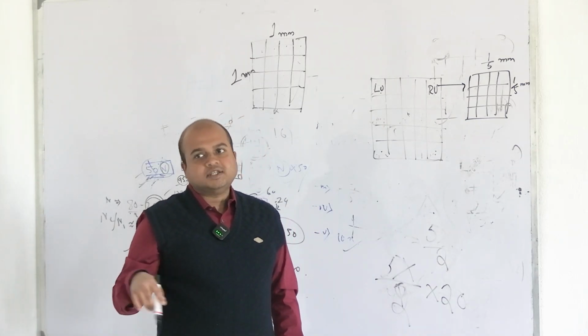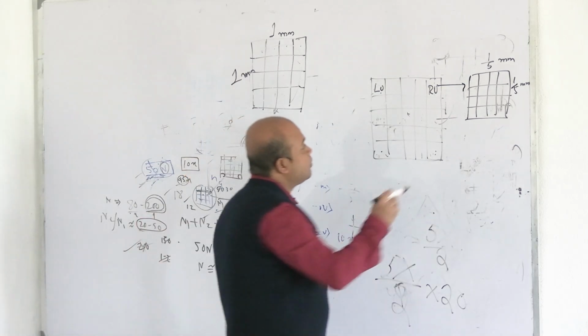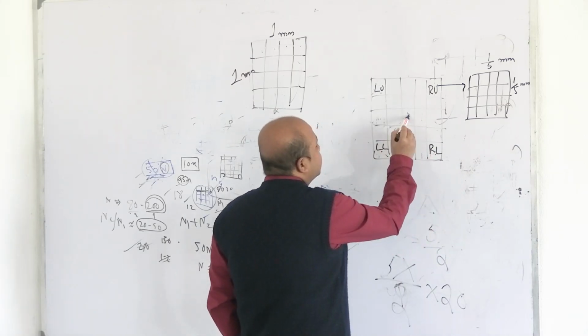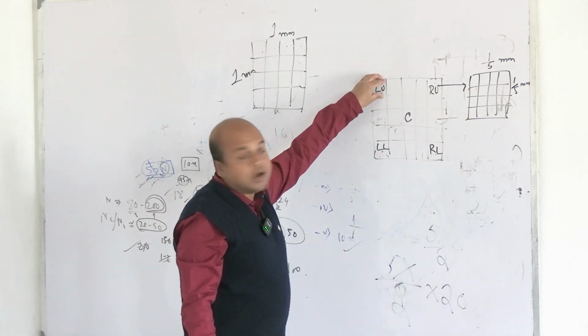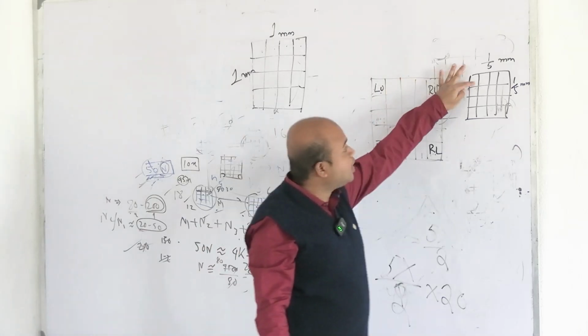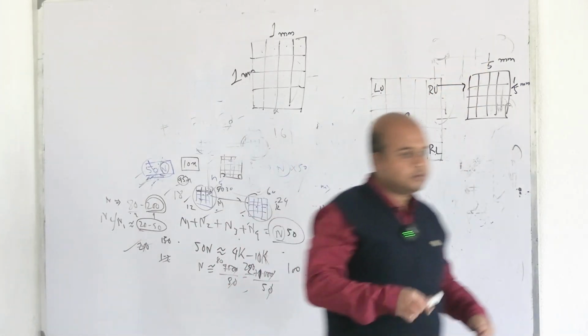If you go on to write 0.2, it will be correct, but there may be mistakes in calculation. So write as 1 by 5. Left upper, right lower, left lower, and central among the RBC squares, each is again divided into 16. Now even to count this one, as density of cells are more, we need to count these 16 individually. And what is the rule of counting?